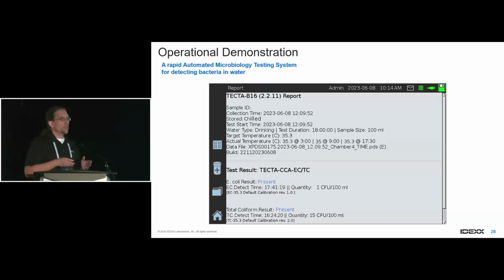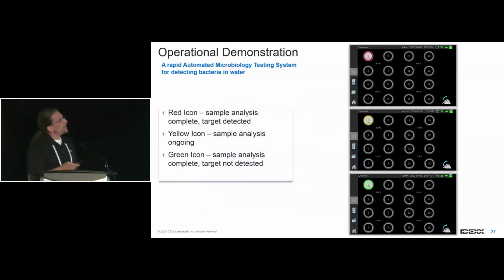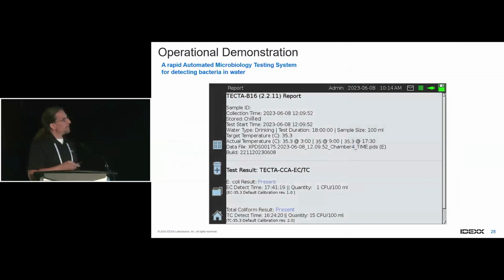And then during the incubation time, it's going to record several times during that incubation and collect that information and present it onto the report. Because if you do incubators in your lab, you're supposed to look at the temperature at least twice a day with 4 hours in between. So the Tecta instrument is doing that for you and collecting that information as it goes. So actually one thing I'll point out here that I didn't is that in this chamber here where we have one going, if you look, there's a number here in the middle. That's basically the average temperature for that incubation section. So that is a visual cue telling you where it's at. But again, the actual report will give you several data points.